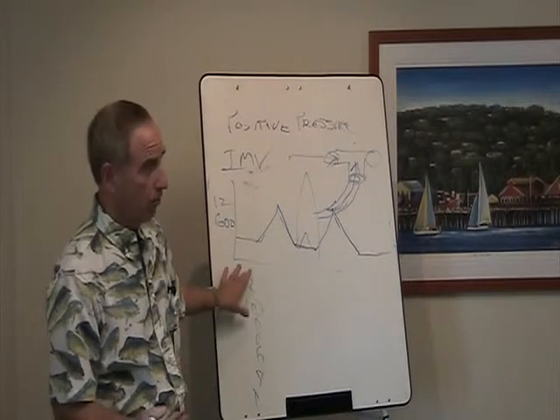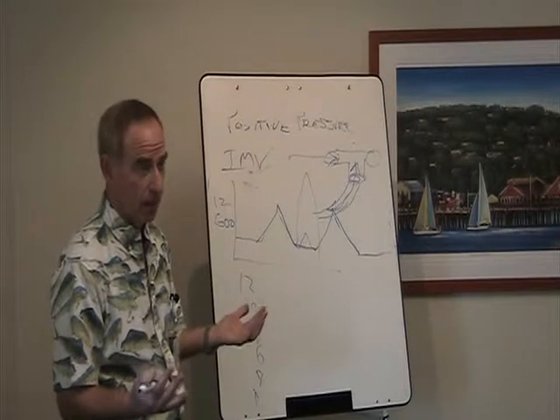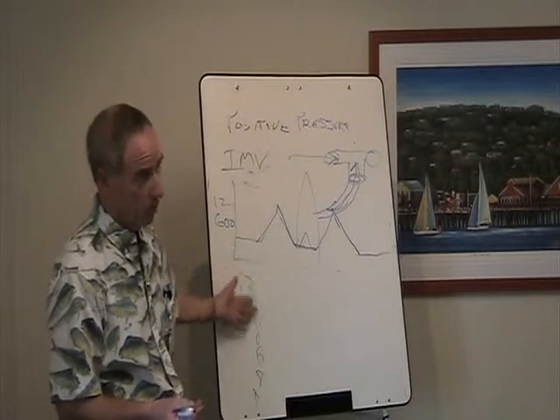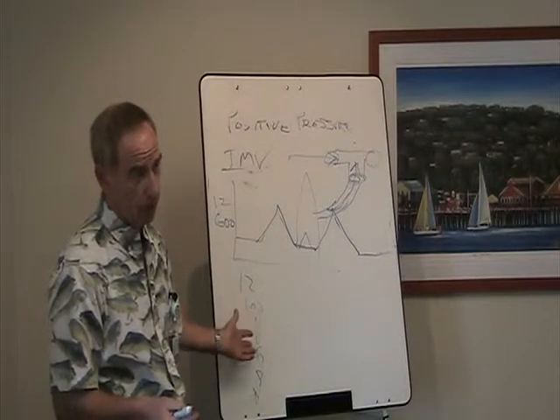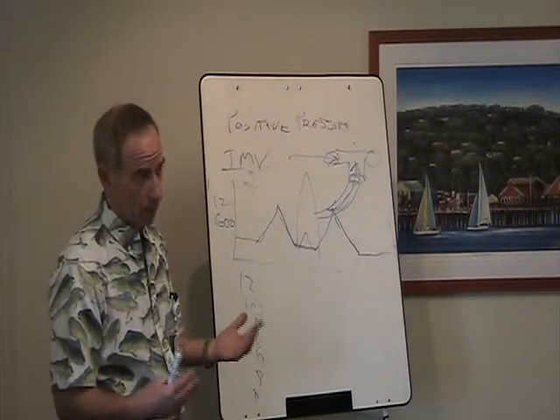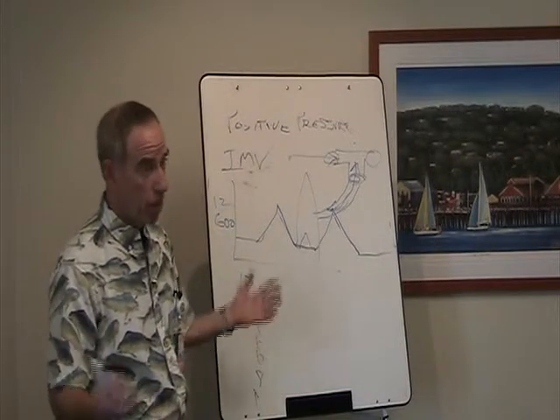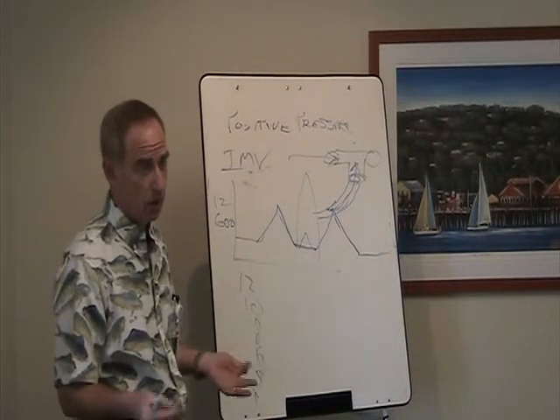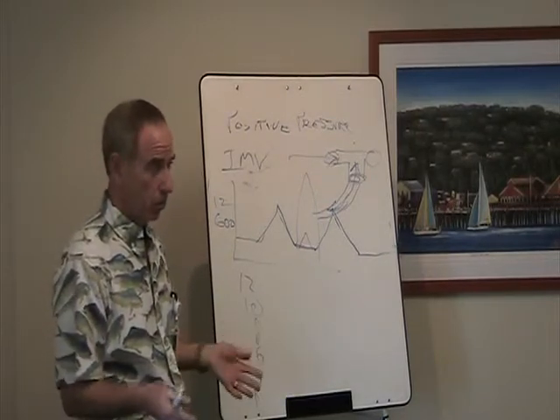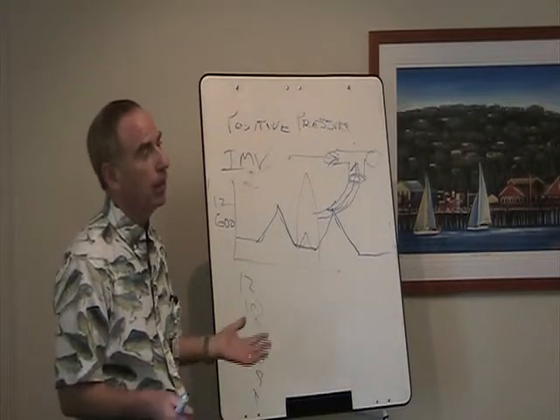And as you went down from one level of support to the next, the idea was the patient had to pick up the difference on their own spontaneous breaths. And if they were tolerating that well, you would go down to the next level, okay? So it was thought to be a better way to wean people. And that's really why it was developed. Soon it became the most widely used mode of ventilation in the United States, not in Europe, not in the rest of the world. But in the United States, it became the most widely used mode of ventilation, even though it wasn't really designed to just start people out on that.